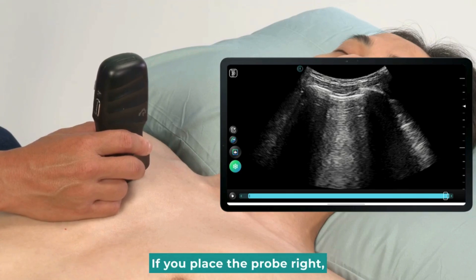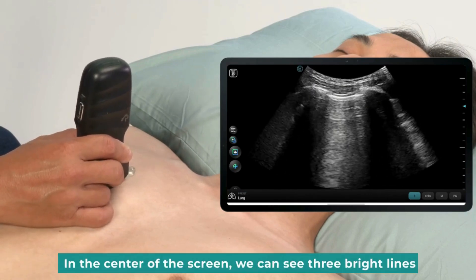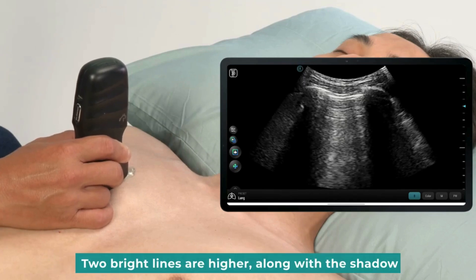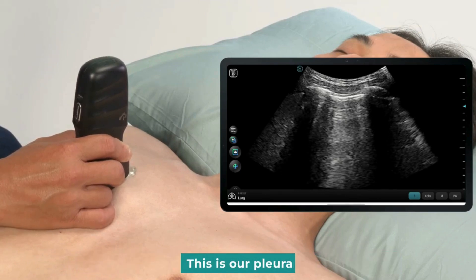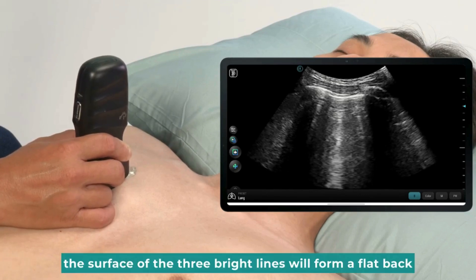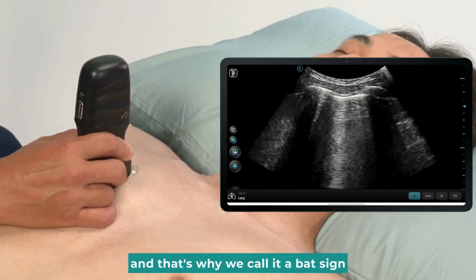If you place the probe right, you should be able to see the BAT sign on the screen. Let's move the probe to this position for a better view. In the center of the screen, we can see three bright lines. Two bright lines are higher, along with the shadow. The line in the middle moves along with breathing — this is our pleura. When we stay at this position, the surface of the three bright lines will form a flat back, looks like the shape of a bat, and that's why we call it a BAT sign.